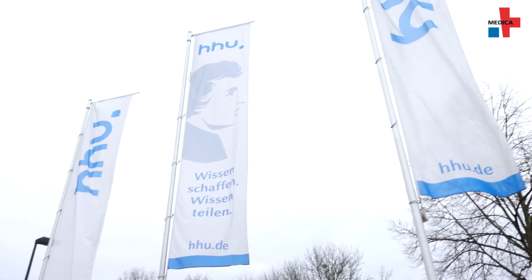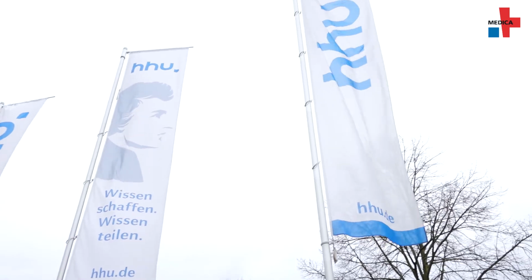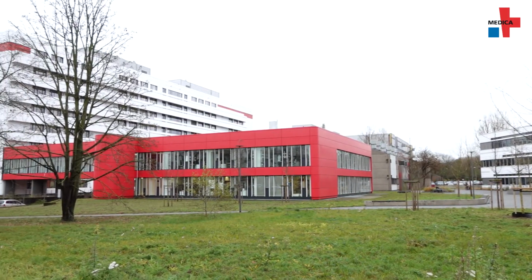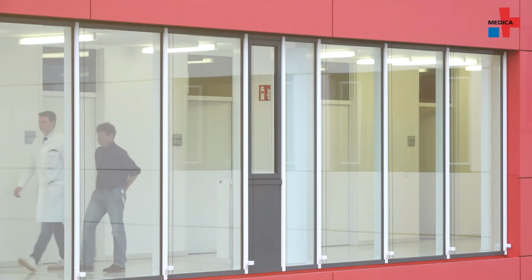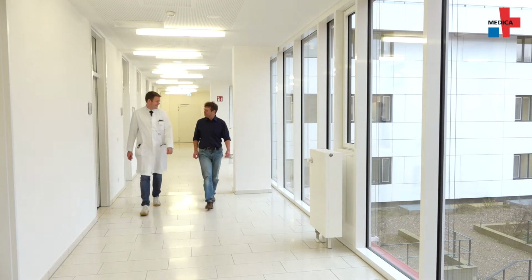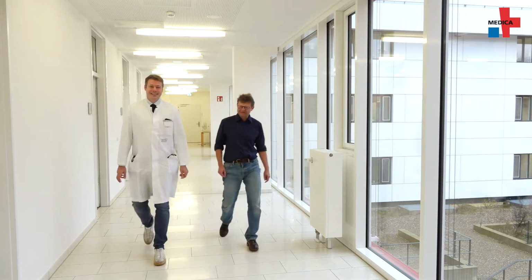Treating lesions in coronary heart disease before they lead to the first symptoms, the dream of every cardiologist. At the University Hospital Düsseldorf, a novel imaging method using magnetic resonance tomography is being tested, which has yielded remarkable findings in small animal models.